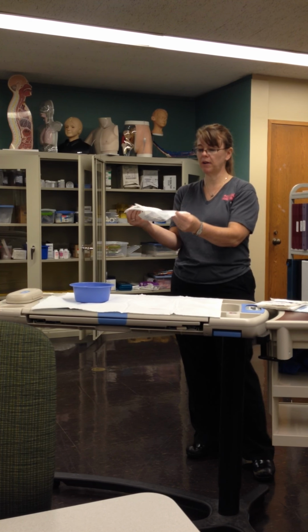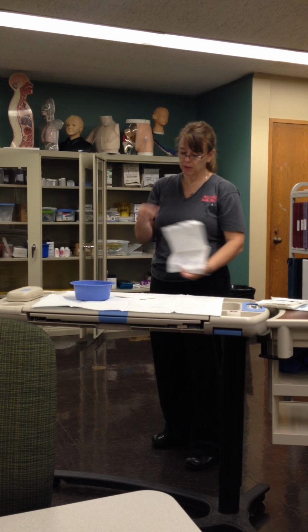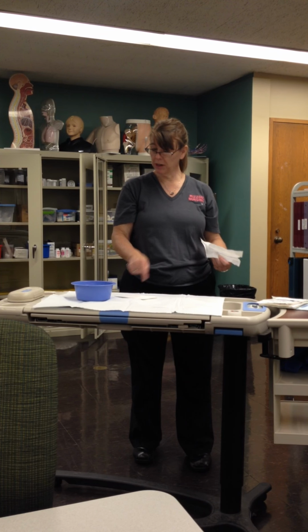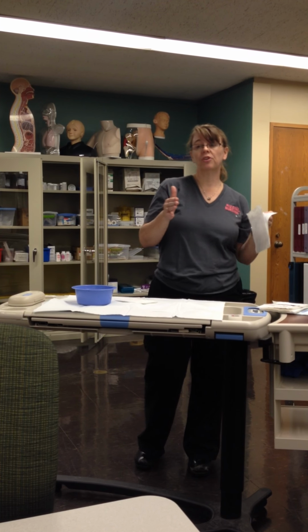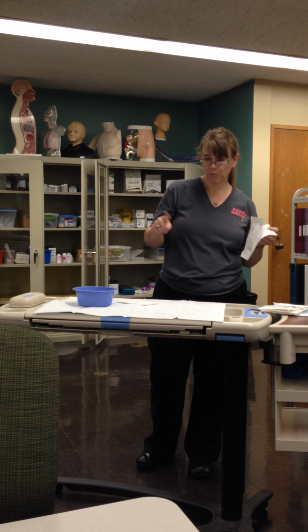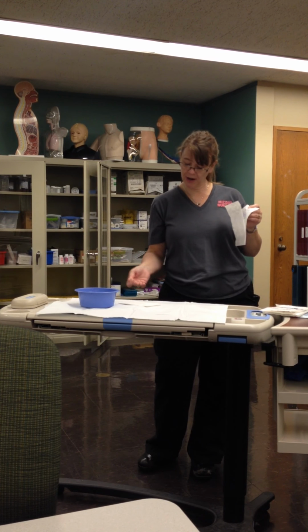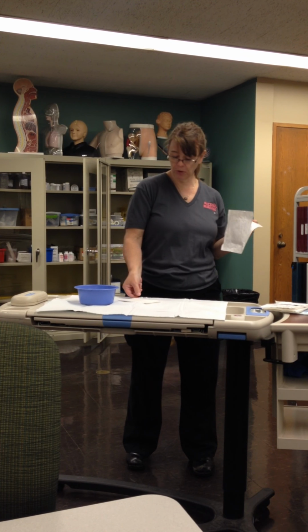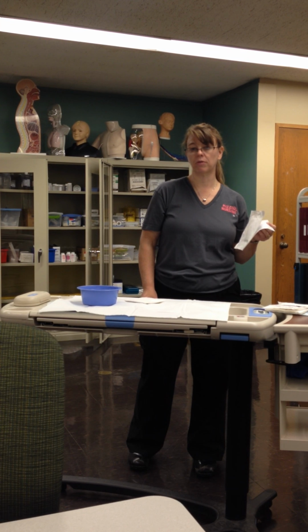One of the easier ways to put these out is to just reach over. Now, here's my edge. It's right on the edge. What did I tell you guys in class? Don't use it. If you're concerned, don't use it. It's not over my 1 inch. It's on that side. This is actually more than 1 inch, so I'm comfortable using that. If it were like this, or even like this, no, I would not be comfortable using that.